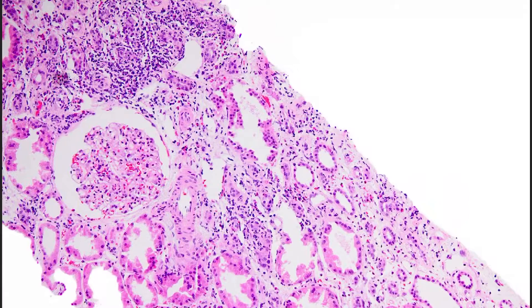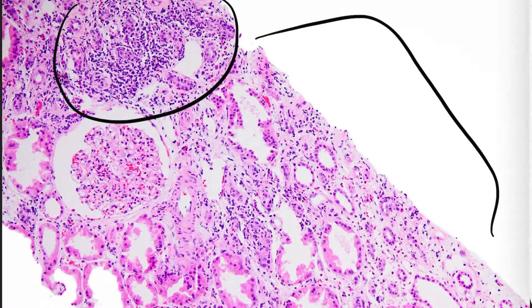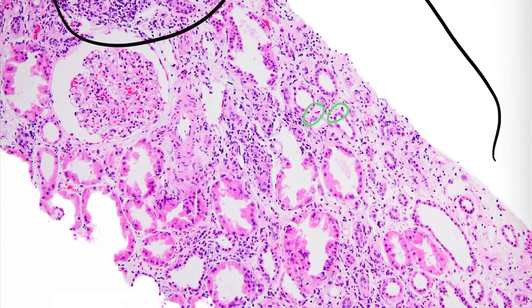Moving on to the next image, if we focus on the interstitial infiltrate, we can see that it is predominantly lymphoplasmocytic. However, there are occasional eosinophils scattered around, although it was not considered a significant component of the interstitial infiltrate.